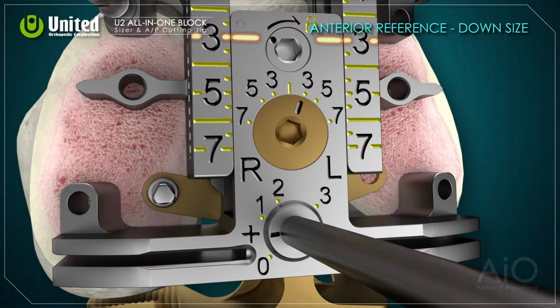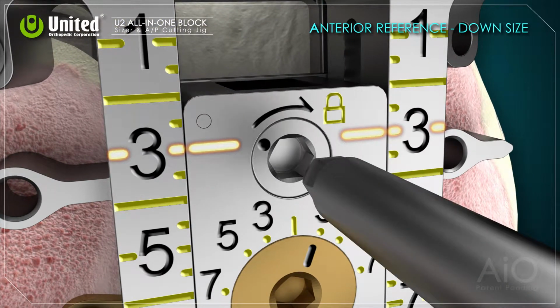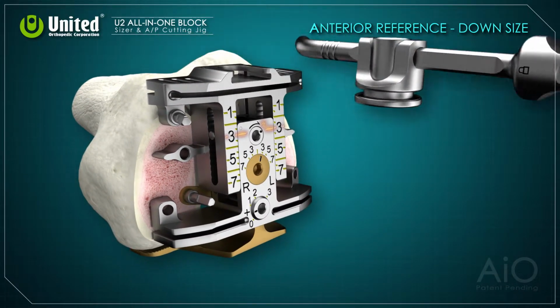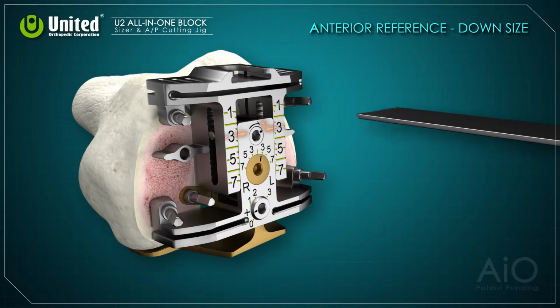The figures next to the bottom knob indicate the additional posterior cut to the standard 9mm cutting. In this case, to match size 3, the adjustment is less than 1 mm. Once the size is determined, rotate the upper knob to secure the chosen size and lock the cutting block. Release the stylus. Secure the anterior and posterior slots with the threaded pins.